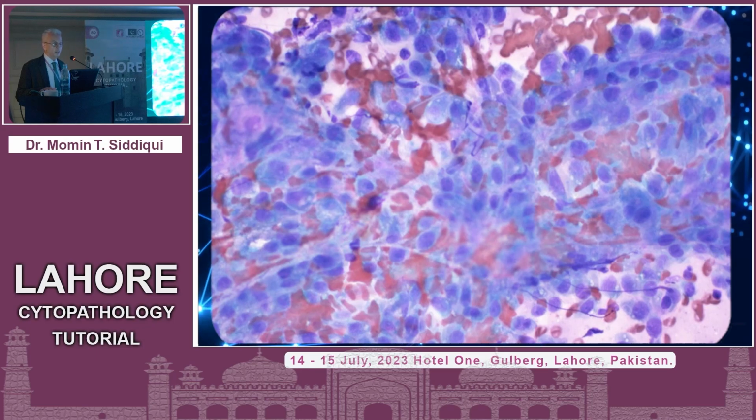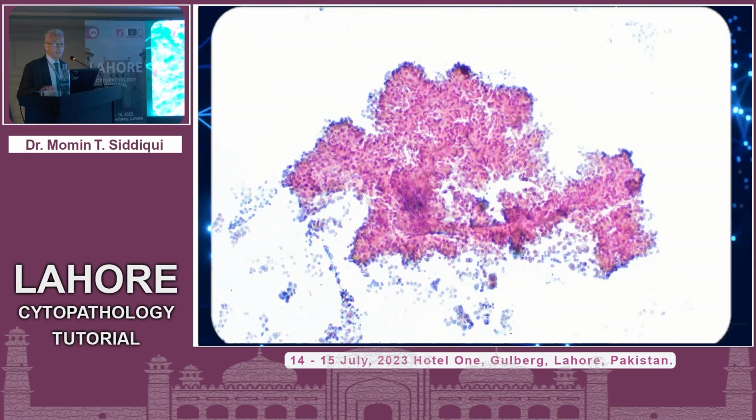I'm going to show you plenty of pictures. Again, a very high magnification, traversing blood vessels there. But very distinct cellular configuration, very epithelioid. Given that location and configuration, I would say most likely an adeno, right?